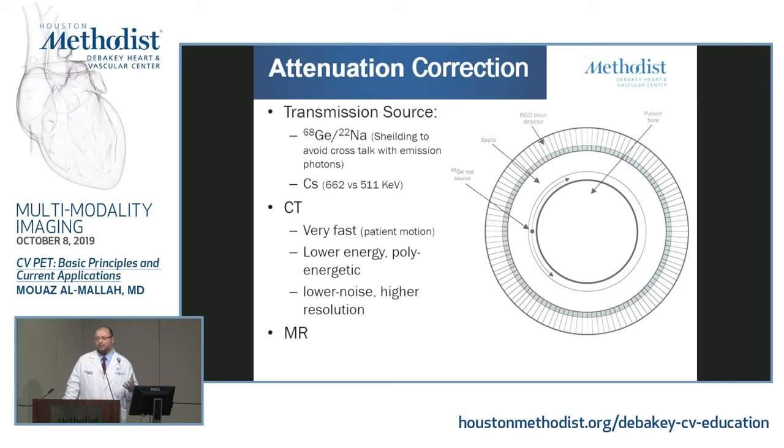All PET systems nowadays, if you want to buy a new one, it's going to be a PET CT. And obviously now there is some research trying to use MRI on PET MR systems for attenuation correction. That's still way distant before getting to become a routine use. But this is one of the areas that those who have a PET MR system are working hard on.